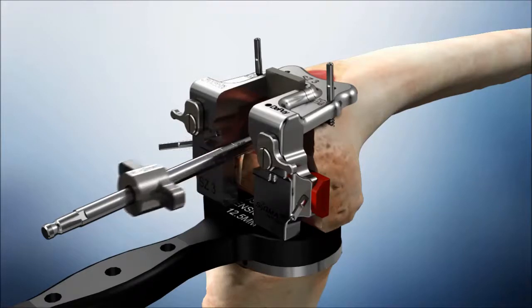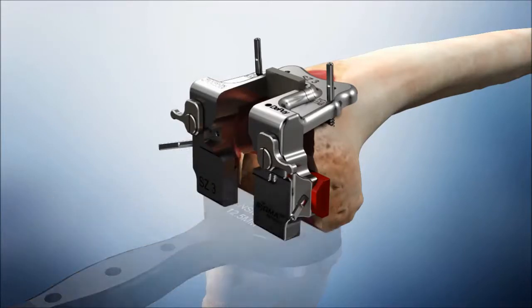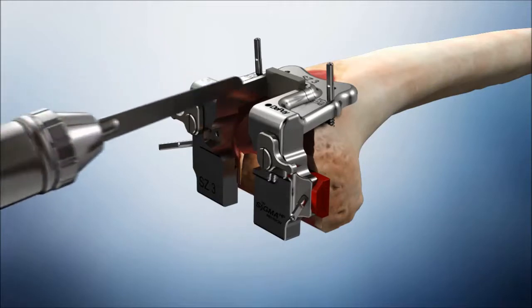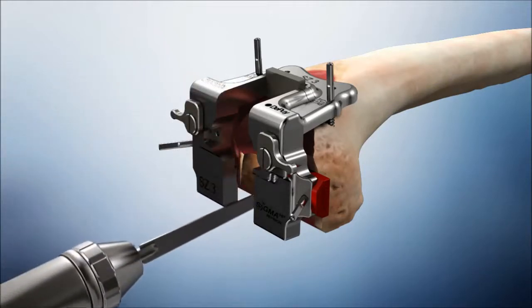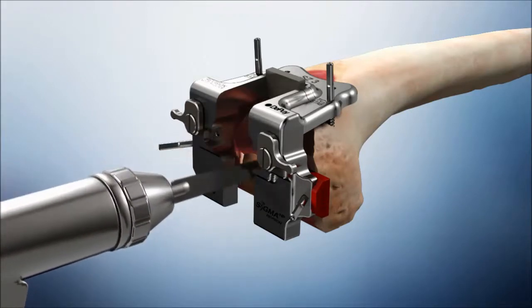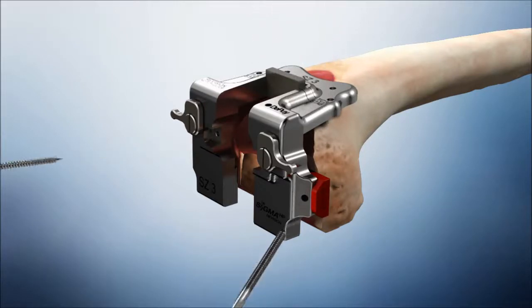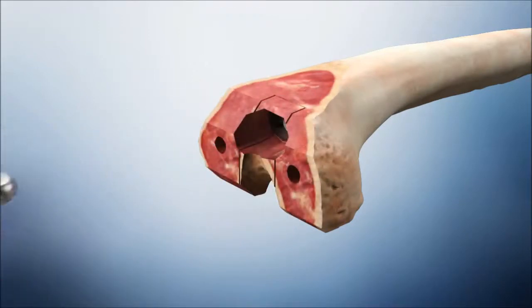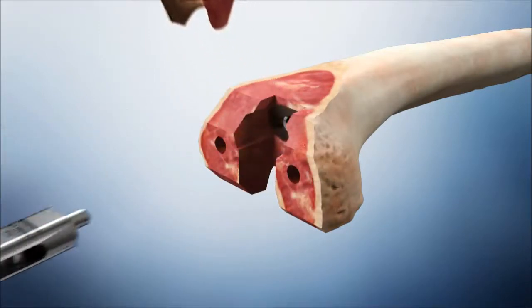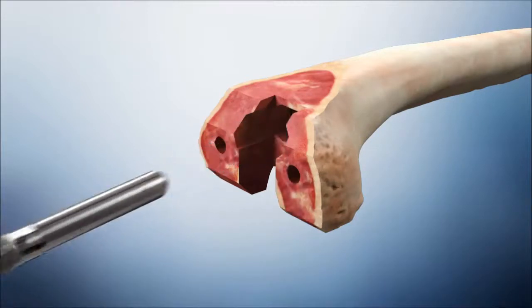Remove the notch bushing and the removable shaft assembly from the canal. Make the notch resection. The TC3 box cut is made through the proximal surface of the anterior notch guide through the slot. Remove the pins, the notch guide and the resected bone. Remove the broach assembly from the canal.